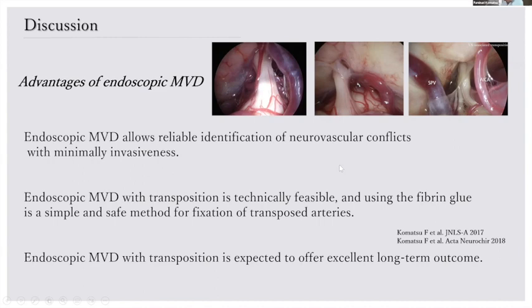So, we don't have the long-term outcome at this moment. So I think the endoscopic microvascular decompression with transposition is expected to offer excellent long-term outcome.